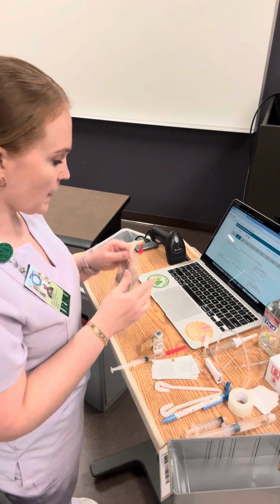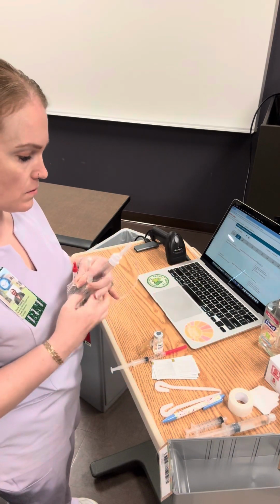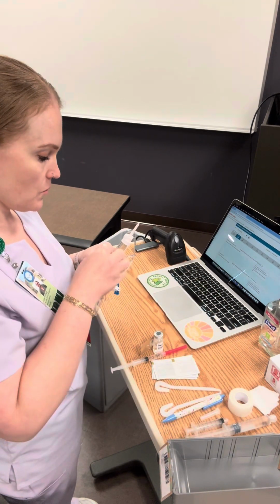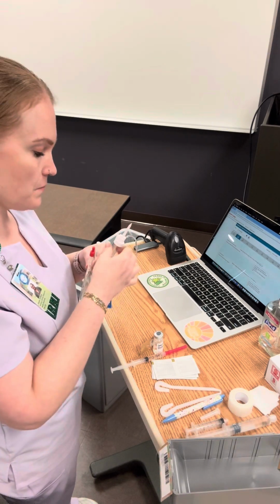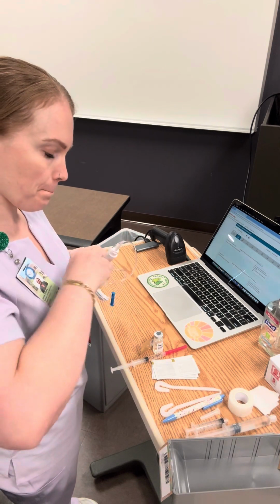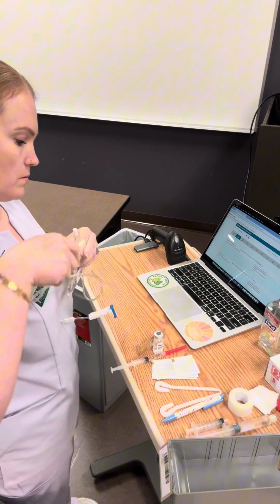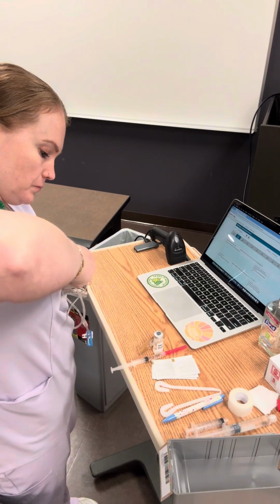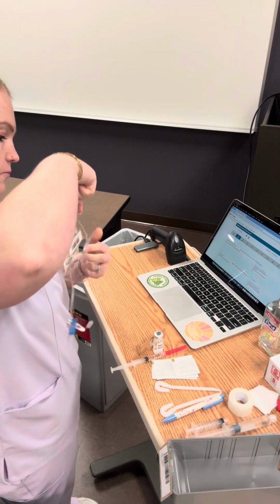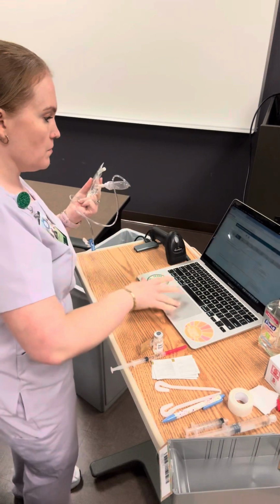And I'm going to take my IV piggyback. I have brand new tubing here. I'm going to make sure that this is clamped all the way down. Then up. Set that in. Just squeeze my chamber.